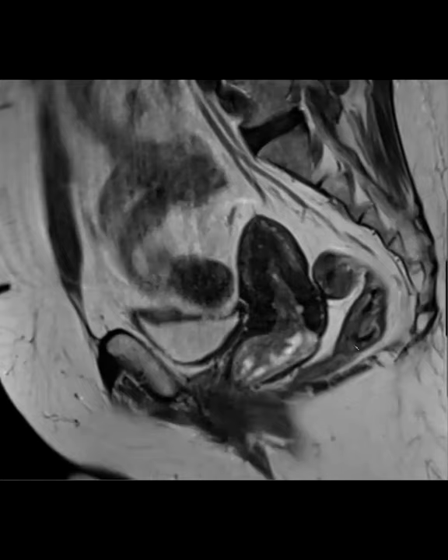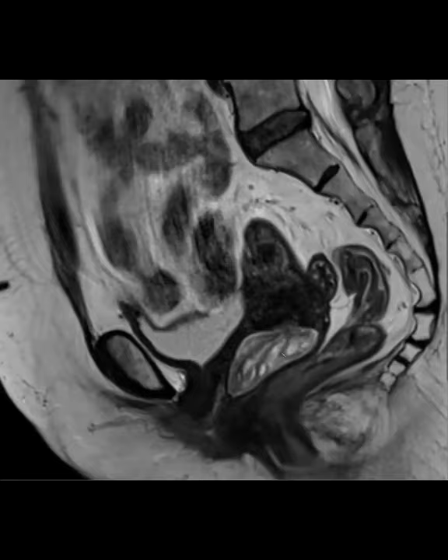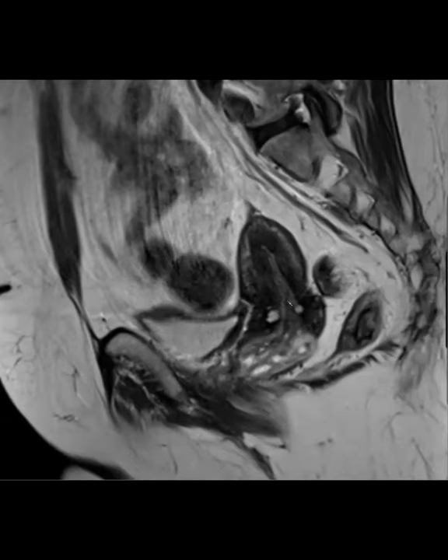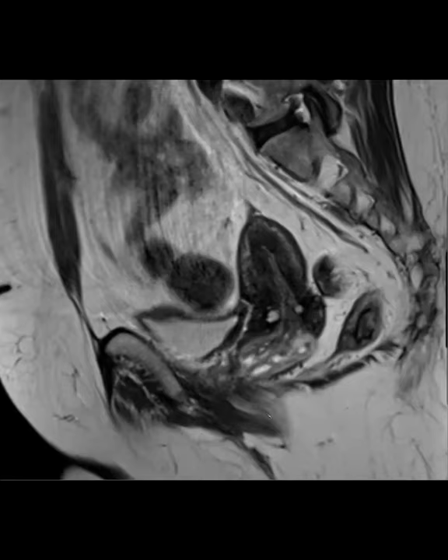That looks like a polyp. Yeah, so this was a prolapsing polyp. Just a large polyp with cystic spaces. And actually the pathology showed extensive edema in this polyp. It had a lot of T2 hyperintensity within it. It was prolapsing down, and we thought the stalk was in this region here. It was basically just attached by one little stalk and the rest of it was not attached. So they were able to resect it. And I'll show you the post-contrast.